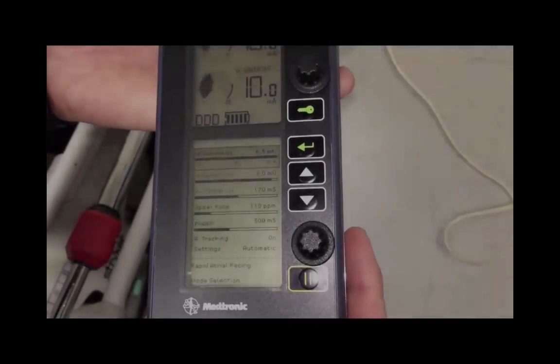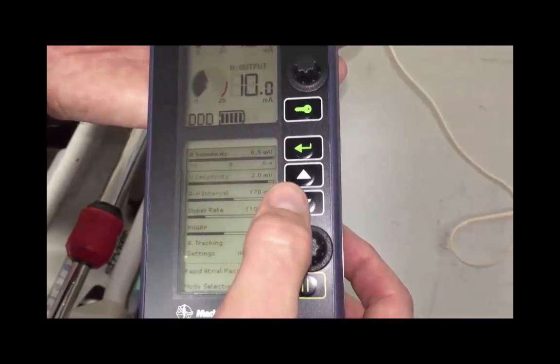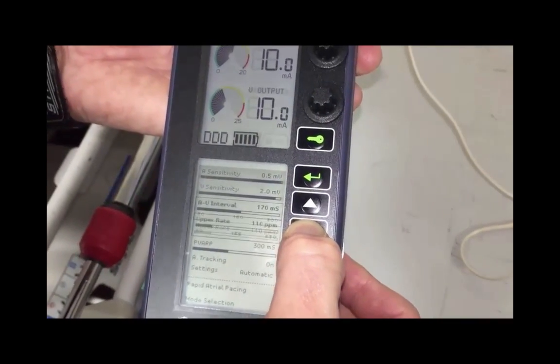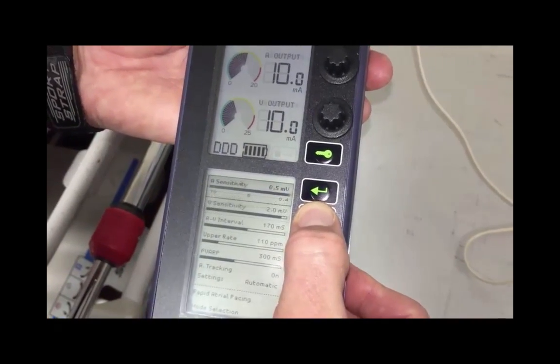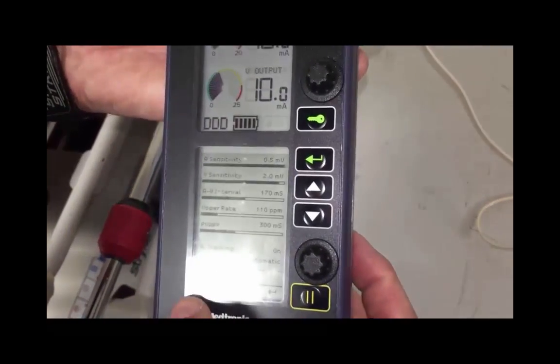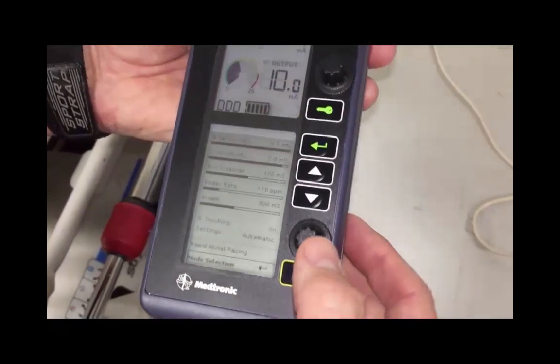On the lower menu screen, use the up and down arrows to scroll through the menus, and the green arrow button to select the menu that you want to adjust. Adjust the settings with the dial. The menus that we typically would need to worry about for our purposes are the A and V sensitivity, as well as the mode selection all the way at the bottom.